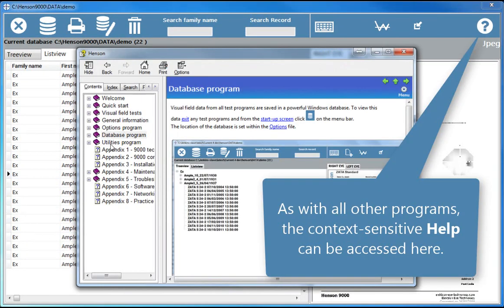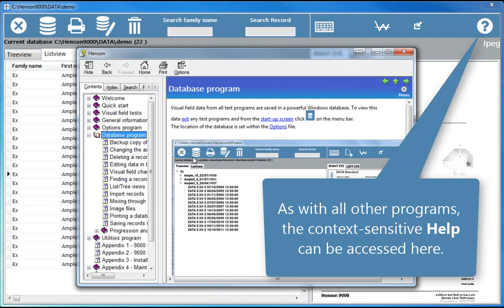As with all other programs, the context-sensitive help can be accessed here.